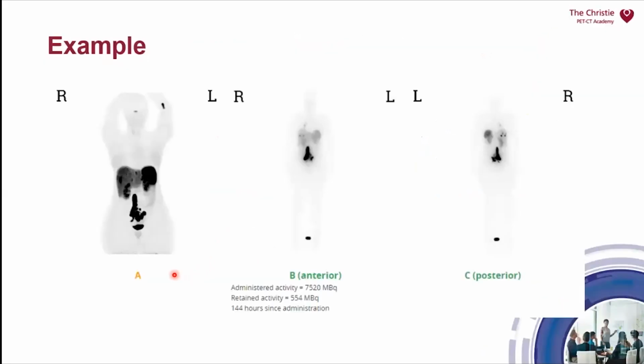An example, this is actually in a small bowel neuroendocrine tumor, because that's where we use PRRT the most. This is a PET-CT. It's a slightly different way of looking at PET-CT images, but this is a PET-CT image that's used gallium PET to show this tumor, which is in the pelvis and is spreading up through the patient's abdomen.